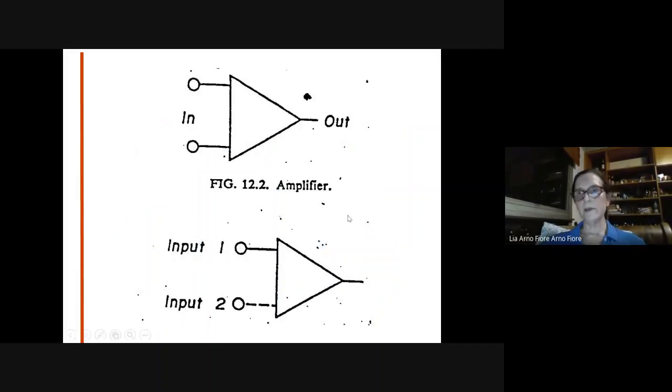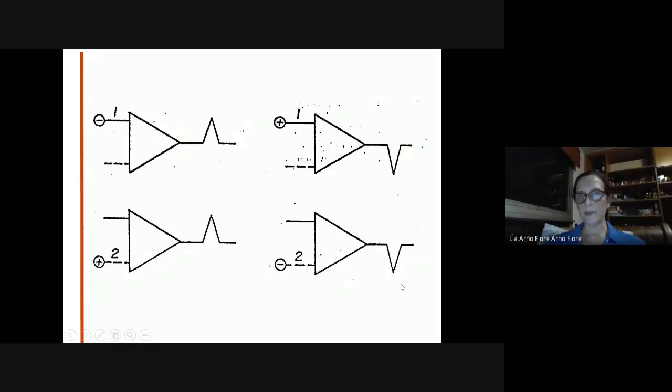Okay, so now the engineers are going to have some fun. Remember I said there are two inputs and one output. The first input is a full line. The second input is a dotted line, and there is one output. Thank you, engineers, because they have made the equipment so that when the first electrode, the first input, grid one, is negative, and the second is therefore more positive, you're going to have a deflection from negative to positive, and it goes up. And on the contrary, if the first one is positive, it goes from positive to negative, so it goes down.